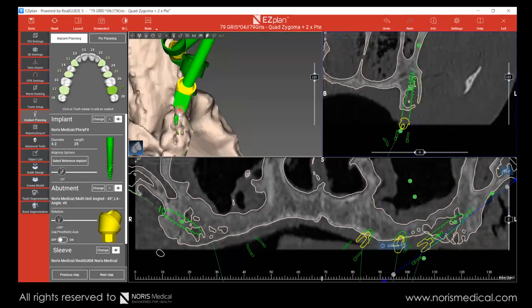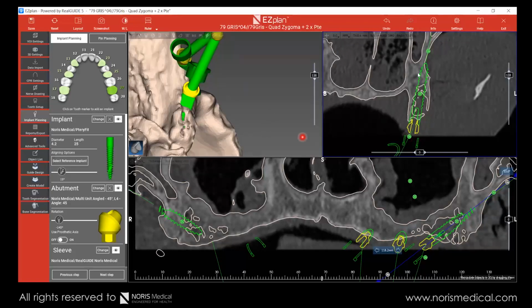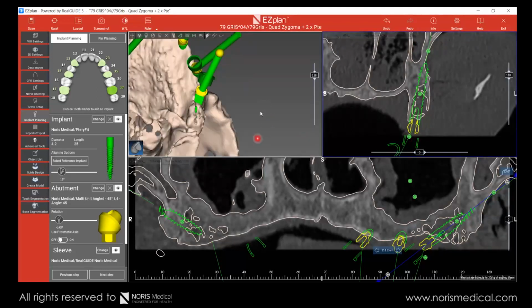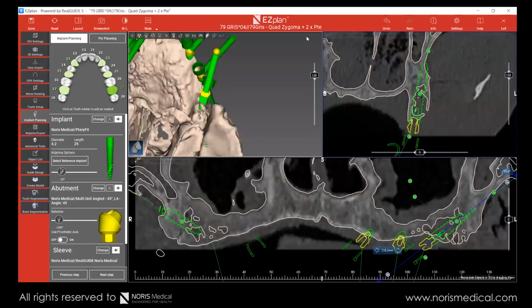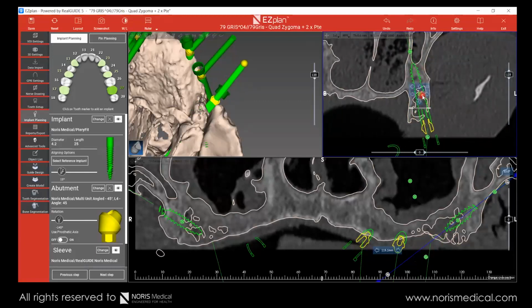The implant is actually going to be on the buccal side of the crest. It's going to be on the buccal side of the crest. You see now it's pointing, this is the medial plate here. Let's see the view that we have. Just a second, I lost you. Let me just have my annotation. This is the medial plate, so we want to be aiming towards the medial plate, and we want to be on the buccal side of the crest this way, like that.